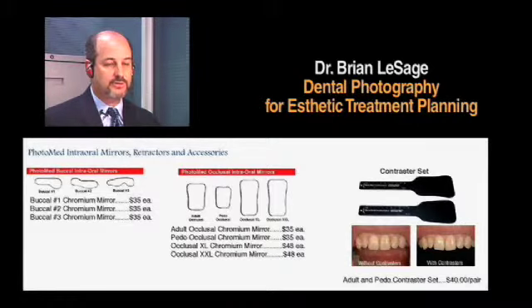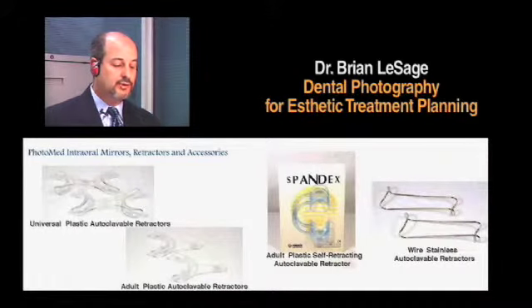Not that I want to be the dental police, so I'm not going to say it is unethical, but I think we do need to come up with what is the standard there, and the profession has not done that yet. My bias is not to take any of those scratches out, so all these images here and all my presentations have just been color enhanced and unsharp masked, no spot editing done. This black background gives you better contrast, allows some of the incisal edge effects to pop out and be a little more visible.